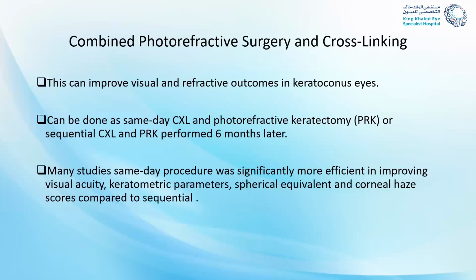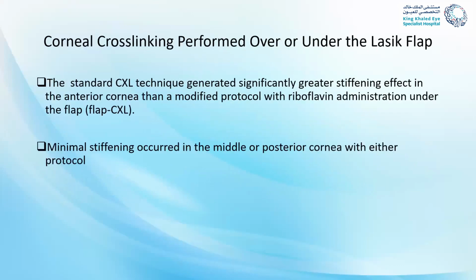I just wanted to raise here the question whether to do the cross-linking and the PRK, such as what is described in the Athens protocol, on the same day, or do it sequentially. Well, the results are variable, but many studies support doing it on the same day. They found that many of the parameters that are studied are a little bit better when you do it simultaneously.